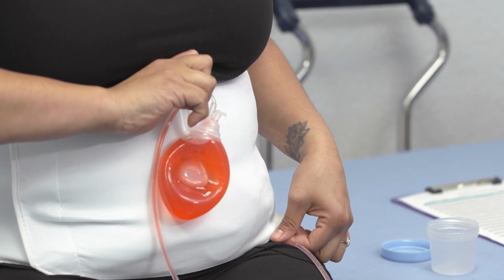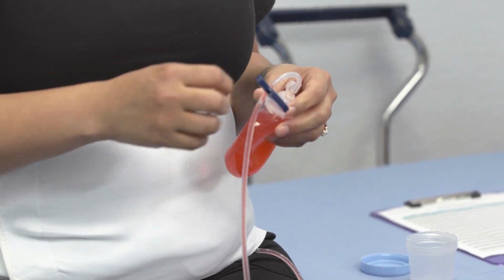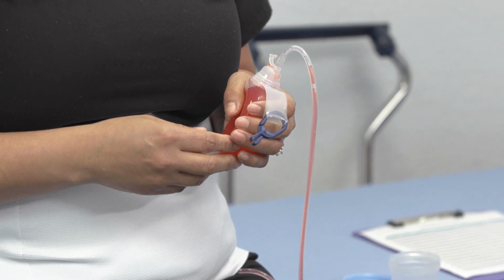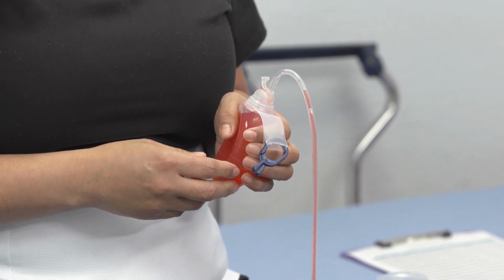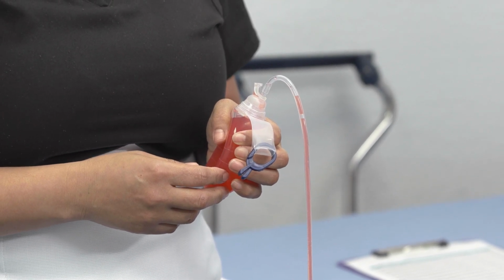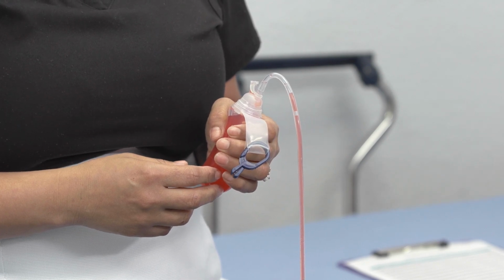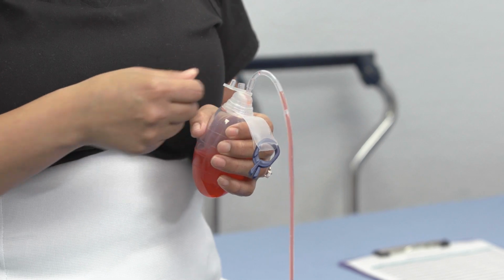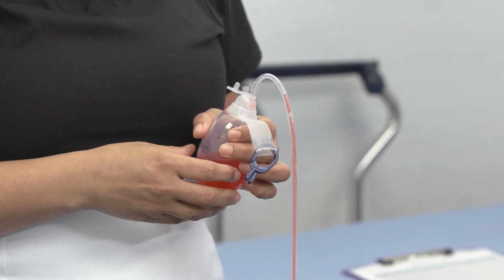Once you are done milking the tube, you are then going to unclip the bulb from either your surgical garment or clothing, wherever you have it clipped to. You are then going to make sure you are holding the bulb lightly, because if you are squeezing on it, when you pop that top off, the fluid will squirt out onto your hand or your clothing. So holding it lightly, you are going to remove the lid. You should notice it decompress if it is not completely full.